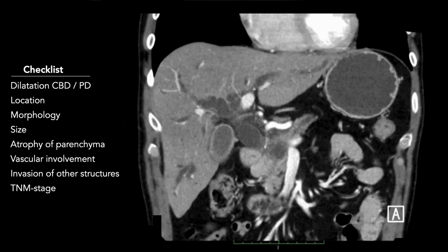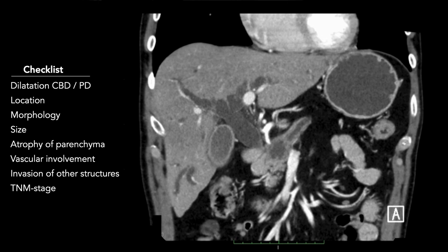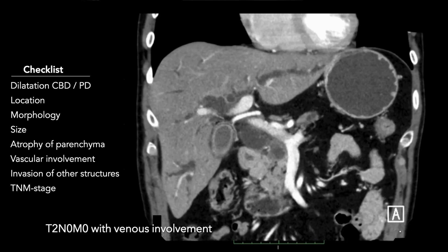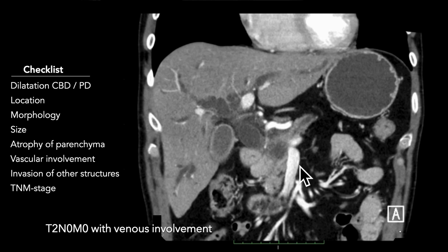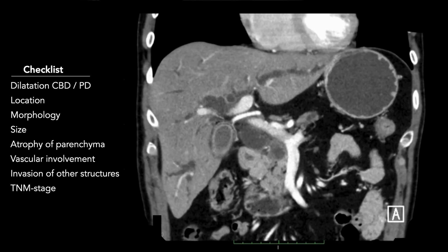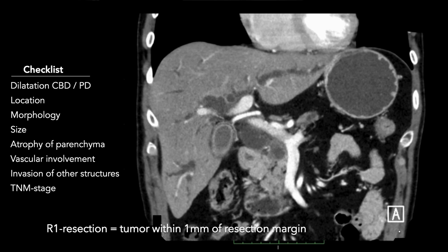In conclusion, we have a 27 millimeter mass in the head of the pancreas obstructing both the bile ducts and main pancreatic duct, with a slightly atypical morphology showing both cystic and solid components. There is a 90 to 180 degree relation to the superior mesenteric vein and less than 90 degrees to the portal vein. Depending on resectability criteria, this would be borderline or resectable. In our institution, this lesion was resected, confirming a T-2 lesion with less than one millimeter margin to the SMV — an R-1 resection.